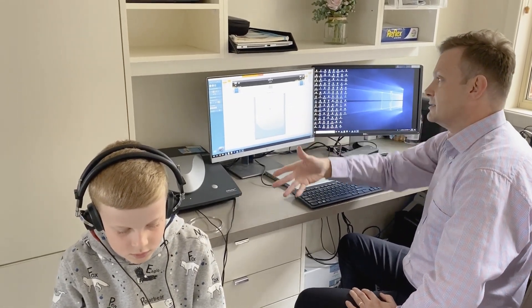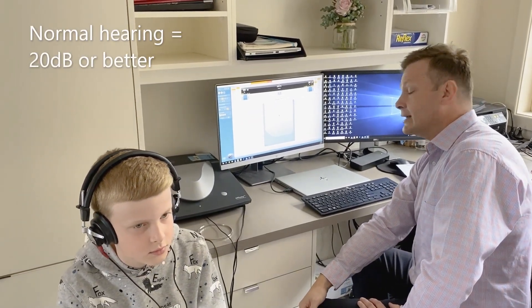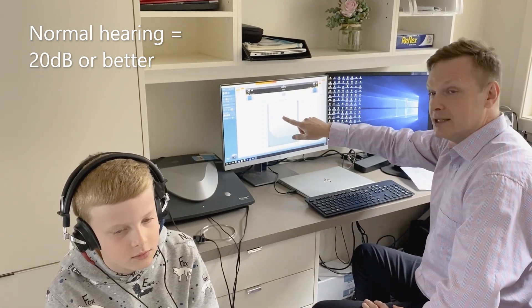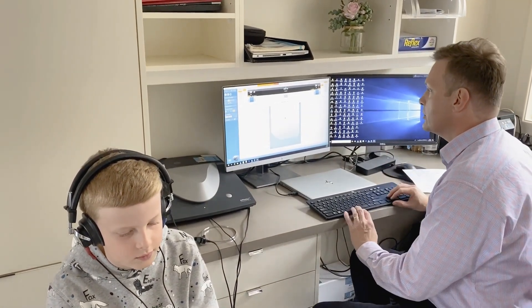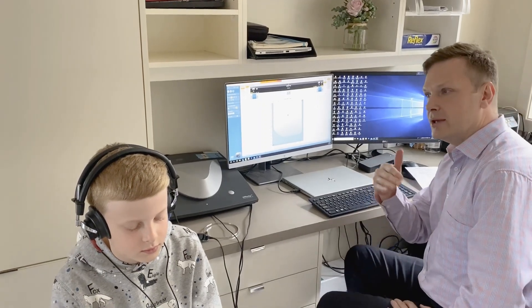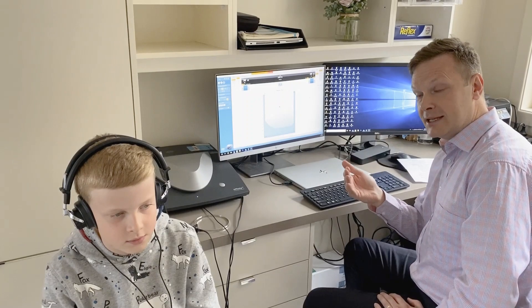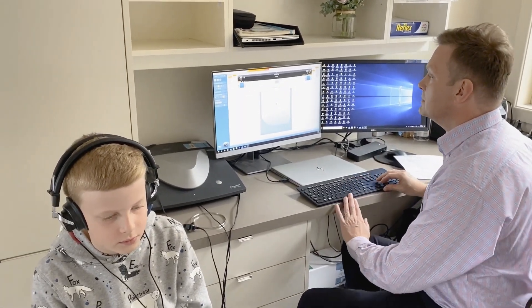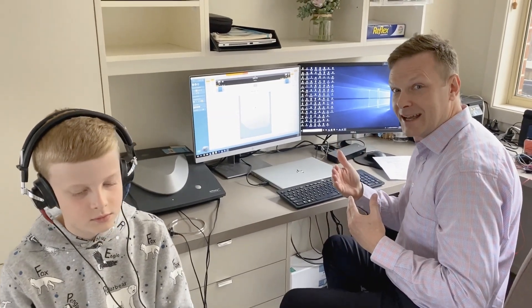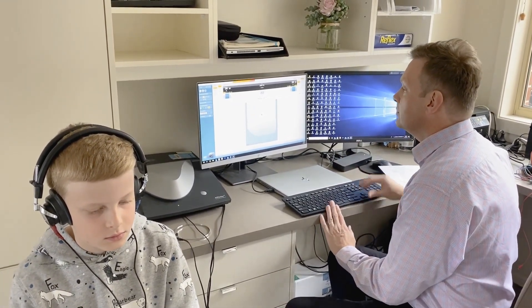Bailey has normal hearing and hasn't reported any hearing issues, so we're going to start at 30 decibels, starting with his left ear. The important thing when testing hearing is not to be too rhythmic in the way you're presenting — vary the intervals between. I'm using the space bar to present the sound.